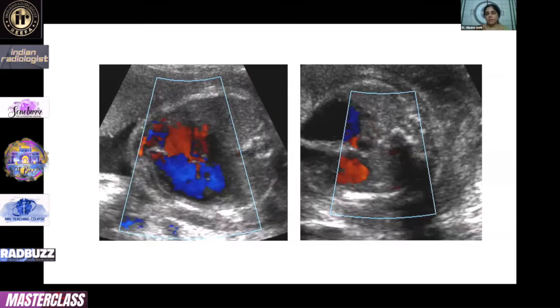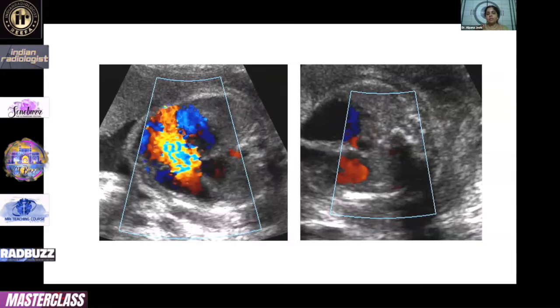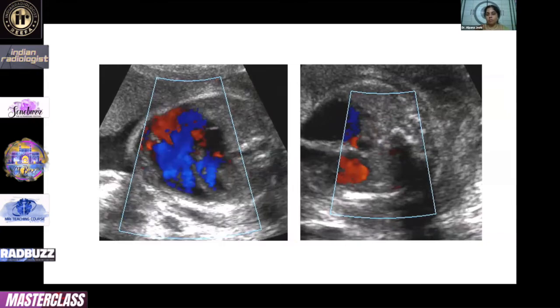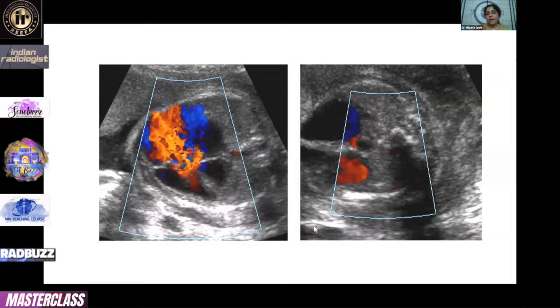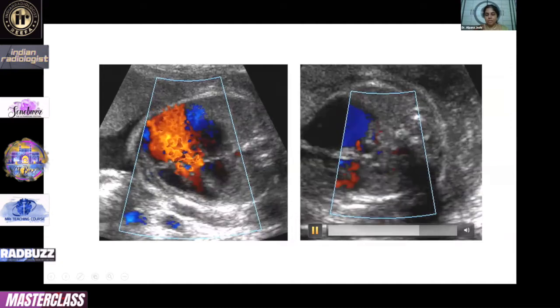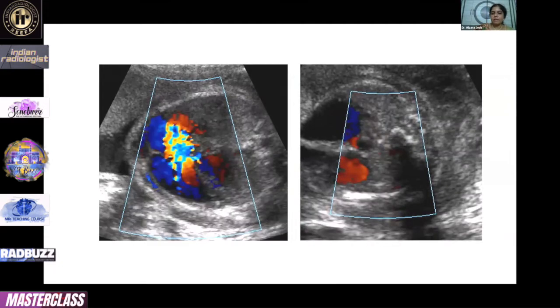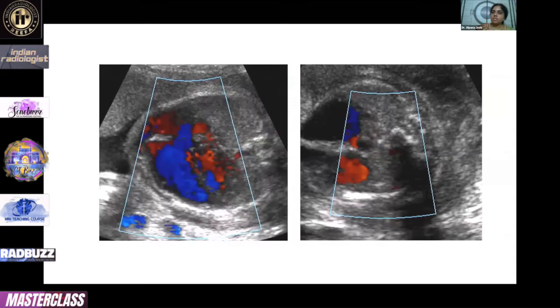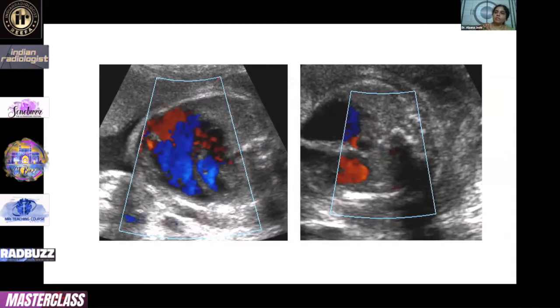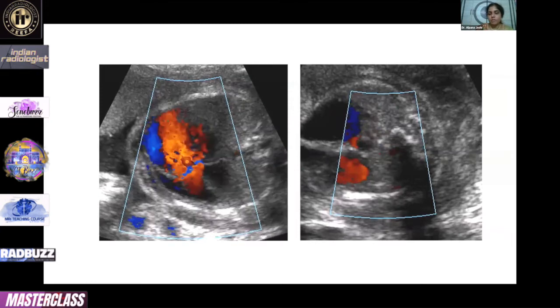The septum was intact, but then we always expect the ventricular cavity to be diminutive. And of course, there is a rare variety of PIVS where you get dilated chambers, but then again, it will always remain a debate whether the tricuspid regurgitation was so much that there was no forward flow, or it was actually a PIVS, and that's why there was so much regurgitation.